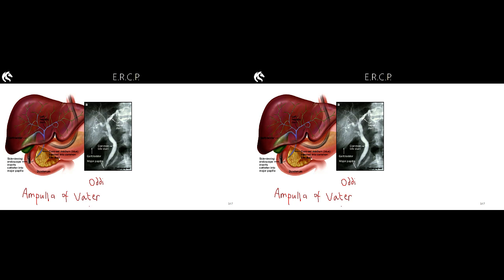I assume a few people here have seen an ERCP happening. So what we're talking about is an incredibly skilled user. We're talking about people who are controlling the movement of a metre and a half long endoscope with just little hand controls at one end, advancing it through the body.